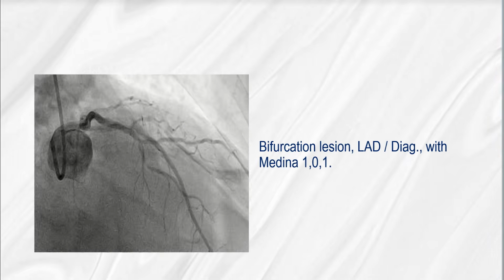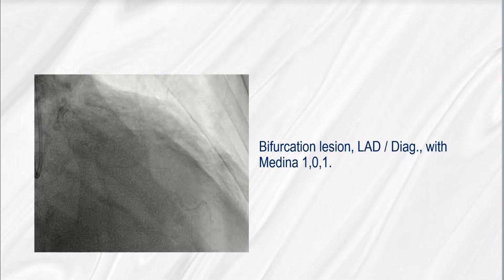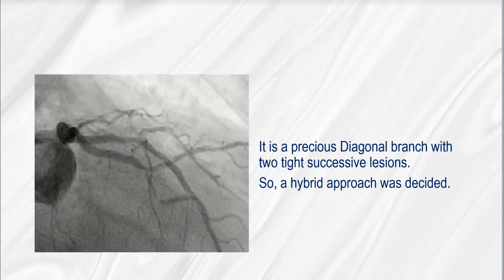In this case, there is bifurcation LAD lesion, Medina 1.0.1. It is a precious diagonal branch with two successive tight lesions, so a hybrid approach was decided.